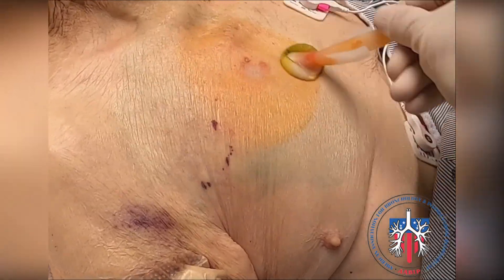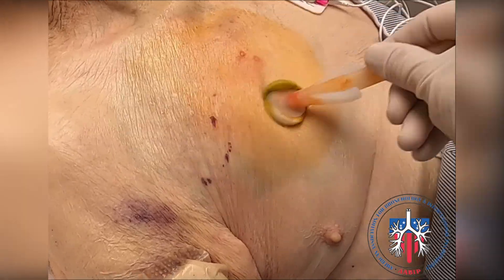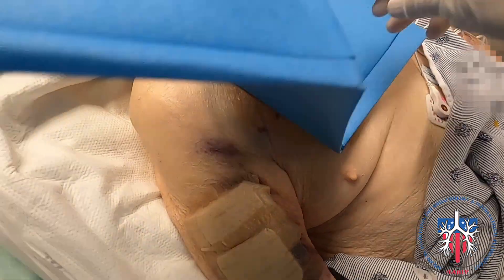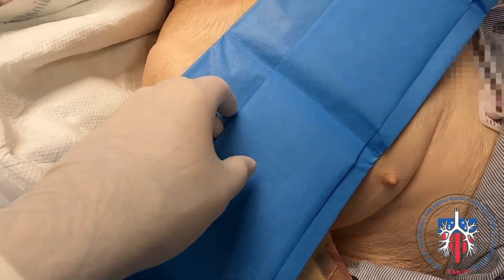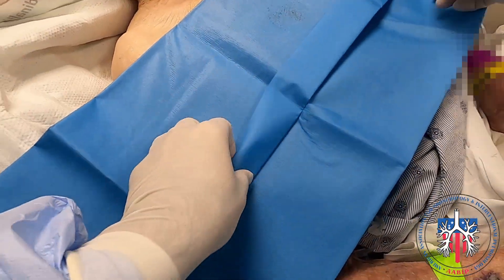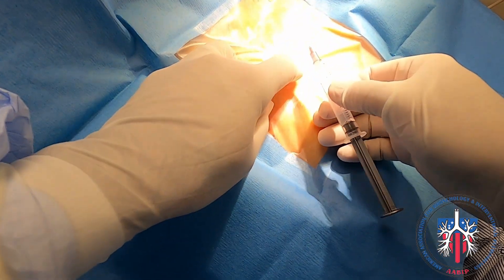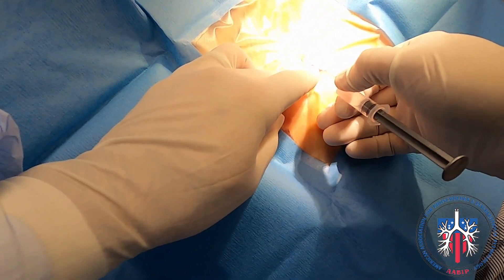We cleaned the area with chlorhexidine and then placed the fenestrated drape provided in the kit. Confirming the position by palpating the rib, we do a subcutaneous injection of lidocaine.